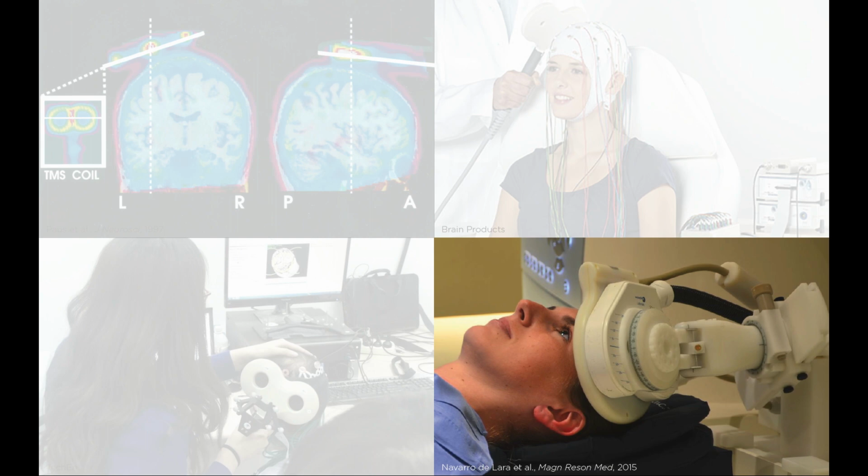And also the stimulator needs to be far away from the scanner magnet, and sometimes the stimulator is placed outside of the scanner room, which places a greater distance between the stimulator and the TMS coil. That means you would have to use a much longer cable connecting the TMS coil to the stimulator, and that creates a lot of losses, and along the way there can be RF artifacts introduced by the scanner.